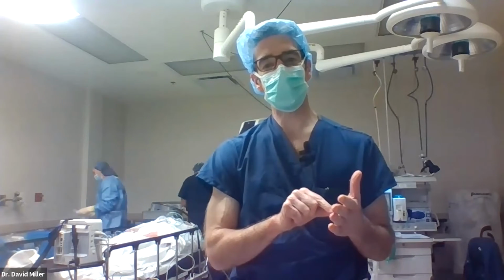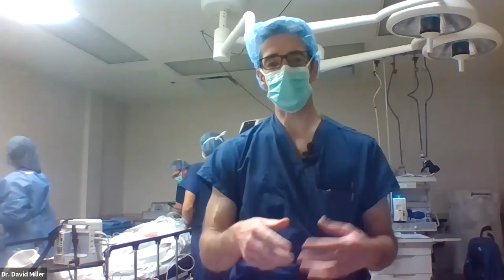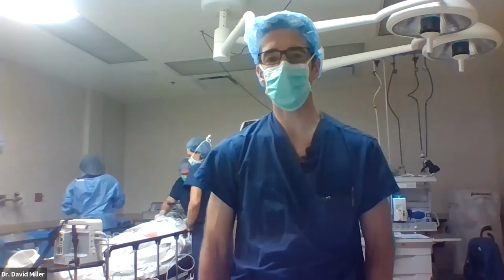But that told me that there was no obvious retinal break. So we're gonna have to struggle maybe to look for that a little bit. Don't like to be surprised. It's always nice to have an idea what you're coming into. Certainly I want to confirm everything in the operating room under the anesthesia, under the more thorough scleral depression.